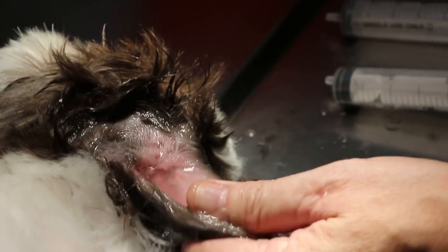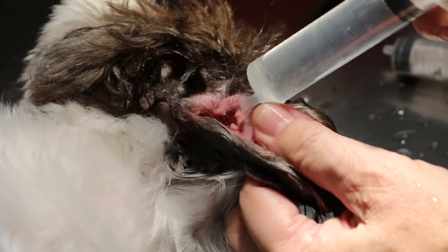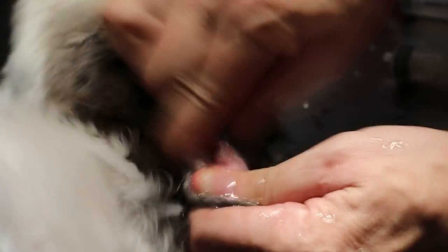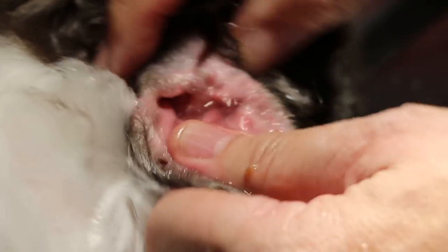You need a 20cc syringe so that there's no excessive pressure. If you use a 5cc or 2cc there's too much pressure. Some earwax came out there — the best is a bit of pressure.